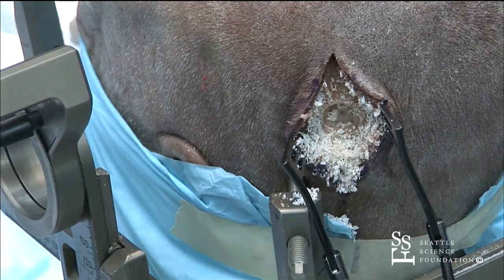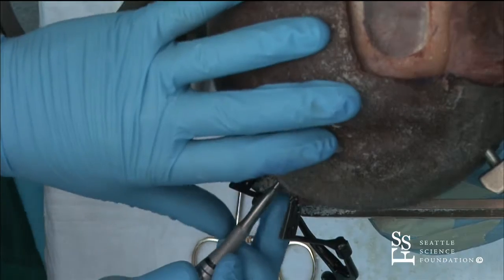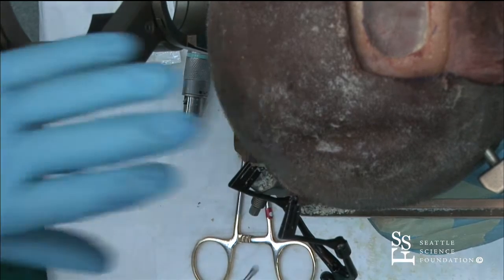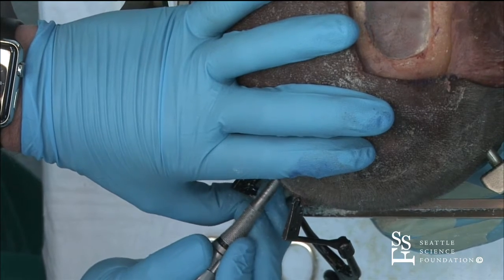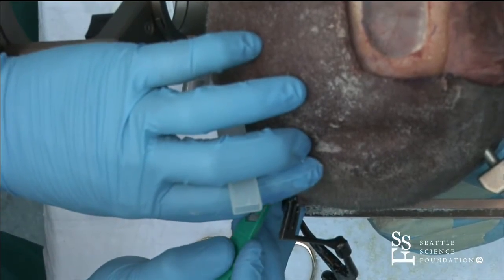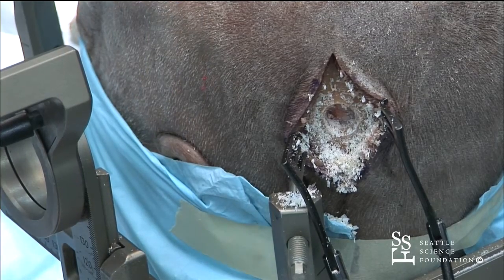Well, looks like we didn't get all the way through. So, all right, we'll open up the dura and we'll put on the burr hole cover.